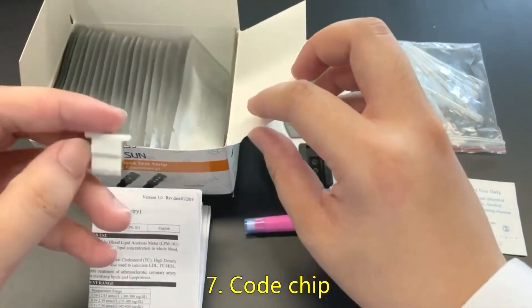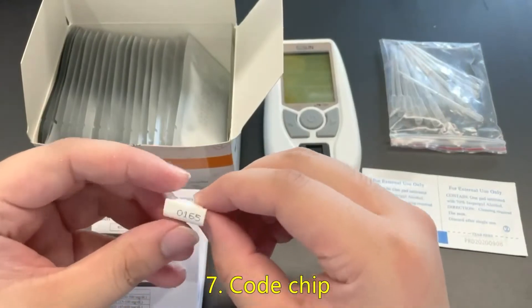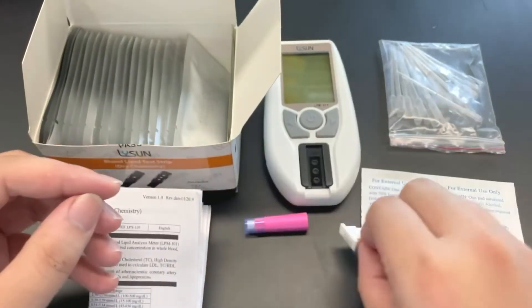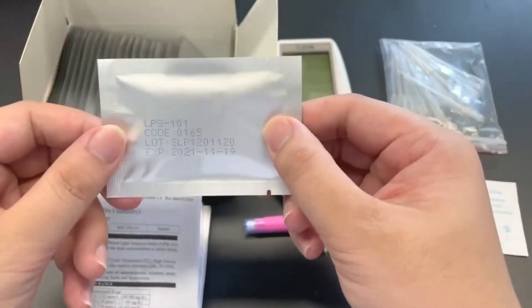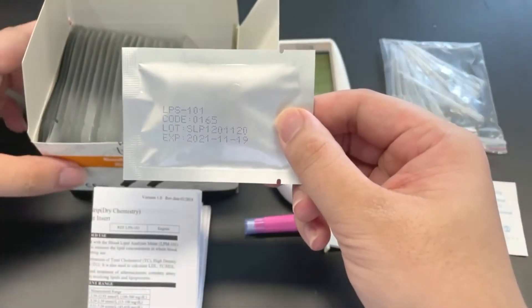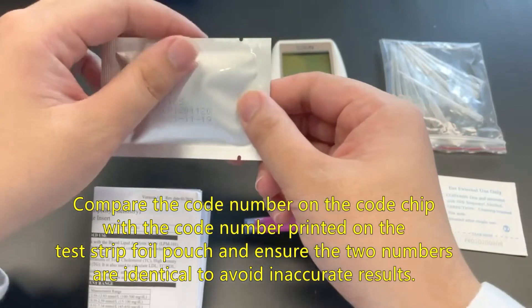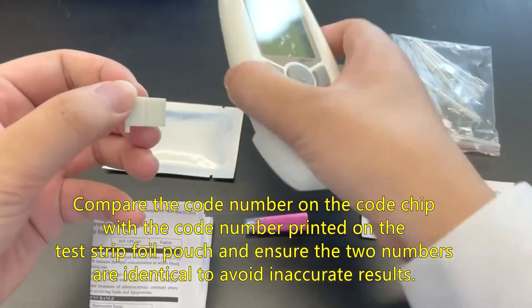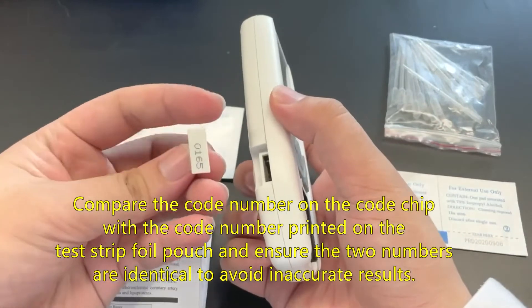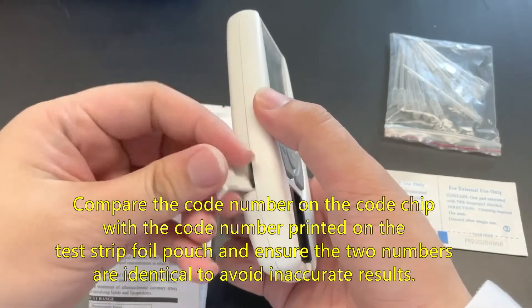Seven, code chip. Compare the code number on the code chip with the code number printed on the test strip foil pouch, and ensure the two numbers are identical to avoid inaccurate results.